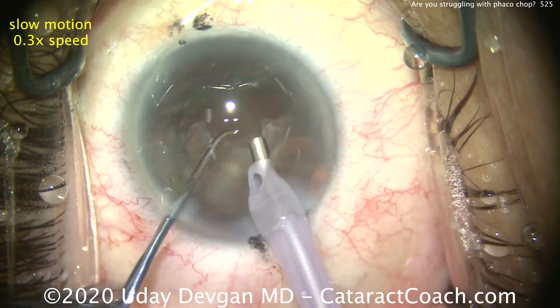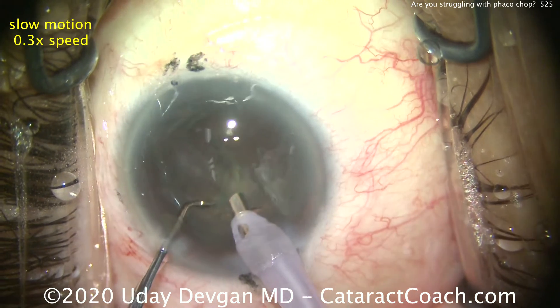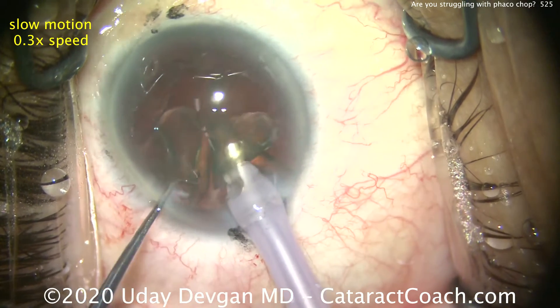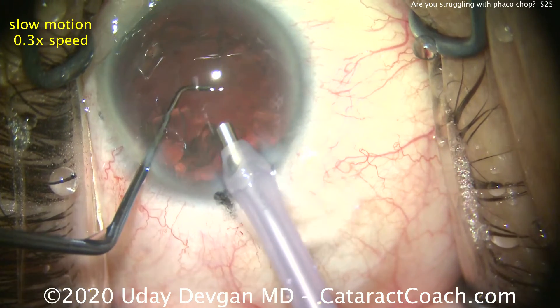I'll bring that towards us. Looks good. Here's the remainder of that epinuclear shell. Pull that up and we're just about done. So that's shown in about one-third speed, 0.3x. I think you really understood that.